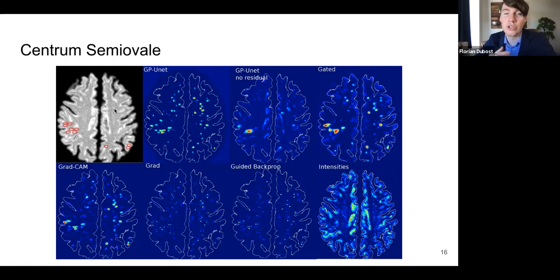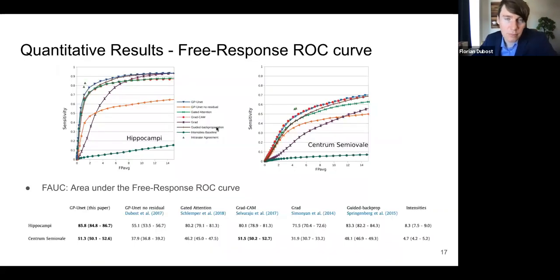So eventually you have to make a choice as a rater on basically how light the perivascular space is on T2, because you could think of the brightness as a marker of its enlargement. So the lighter, the more enlarged; the grayer, the less enlarged. And yeah, so the rater didn't annotate them, but all methods focus on them. So this poses some problem, of course, in the evaluation. I'm going to come back to that afterwards.